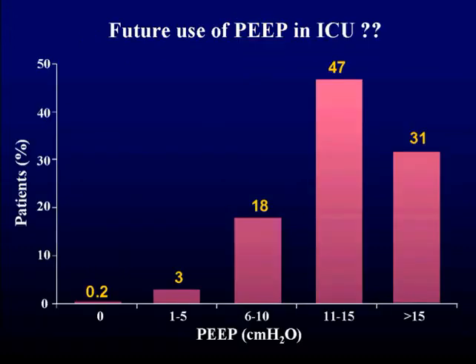And this is a little game I made with the second slide in my presentation, from the work from Esteban. I just used the mirror function of the computer. And if we're thinking of titrating PEEP not only to support ventilation or to improve our oxygenation, but integrating it in a lung protective strategy, we really should seriously think about applying higher levels of PEEP to our patients.